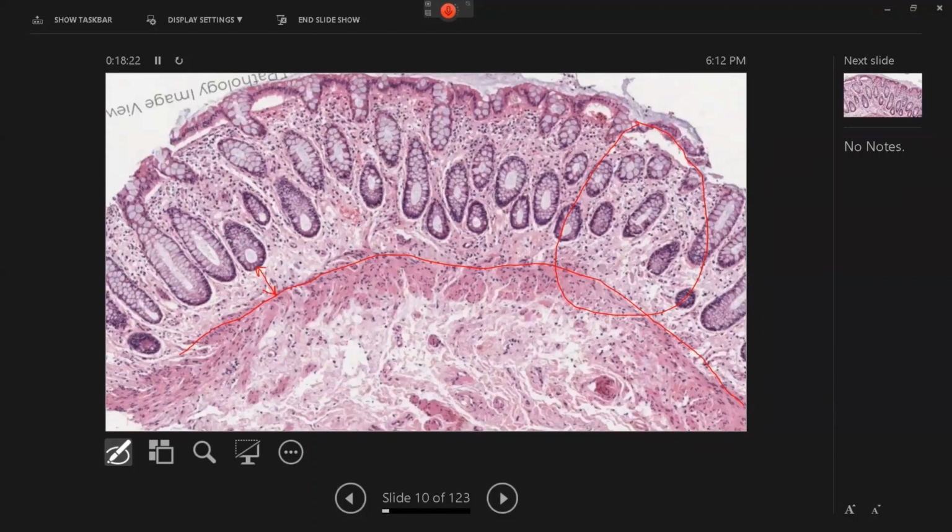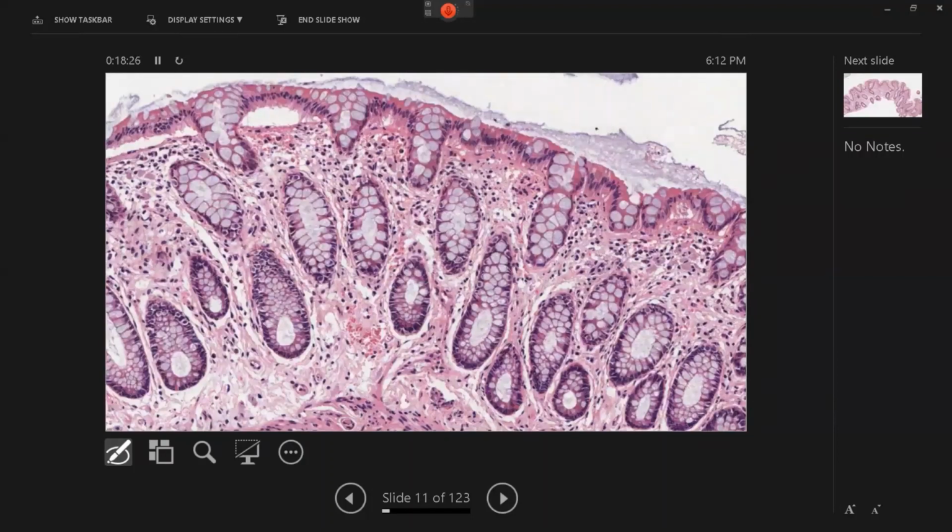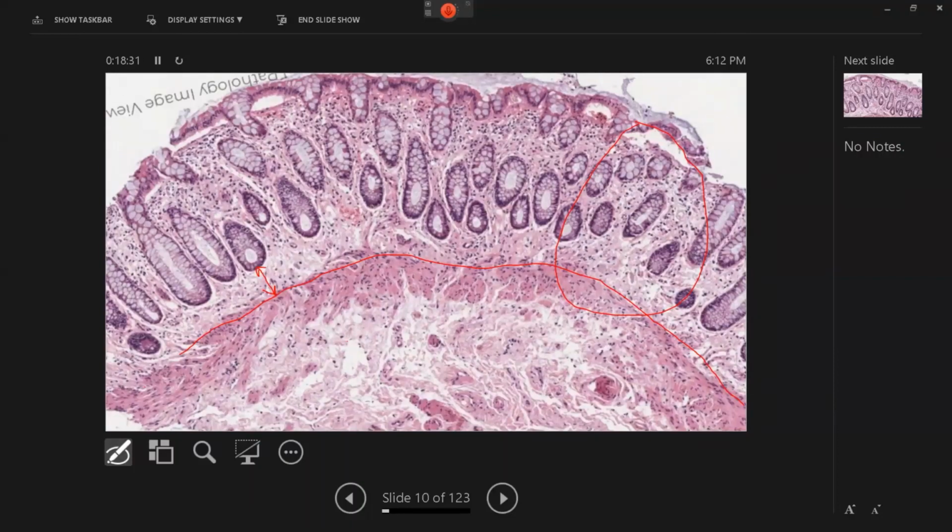Yet this is the close-up just to show you the number of inflammatory cells, how they have decreased in number. But here you can see that most, or nearly all, of the crypts are not trying to touch or reach the muscularis mucosae. So there is this universal picture, which you call crypt shortening, which is one of the features you see with crypt atrophy.